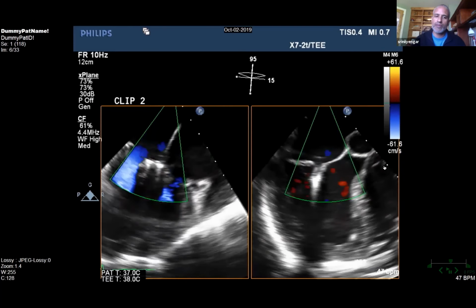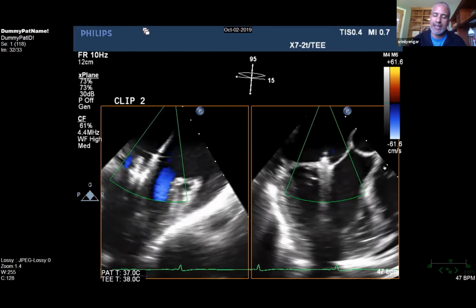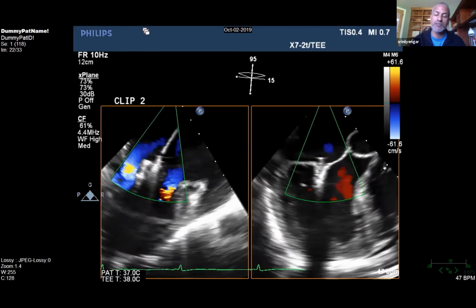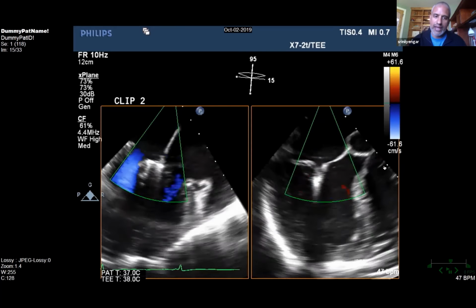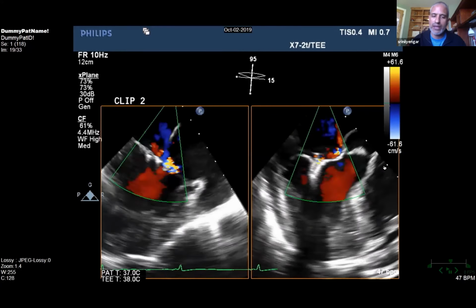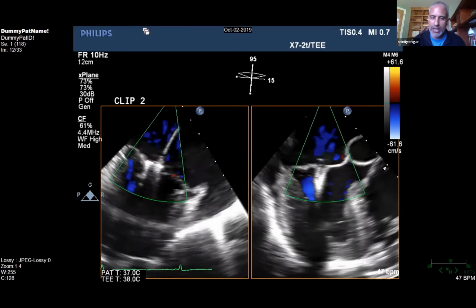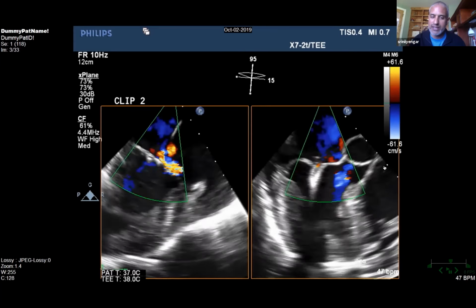And one important facet that I was going to mention initially is in his diagnostic catheterization, as well as on day of this procedure, his V waves were in the mid 30s to 40s. After the placement of the second clip, his V waves significantly reduced and they were down probably in the upper teens. So we had an absolutely great reduction of hemodynamics or a change in hemodynamics in the positive immediately after the second clip.